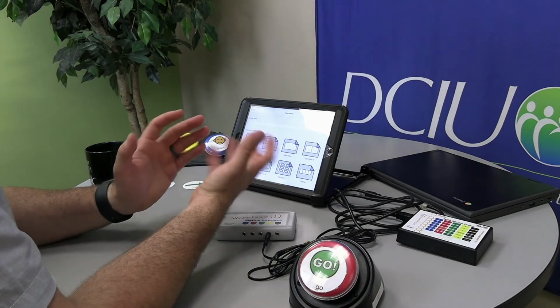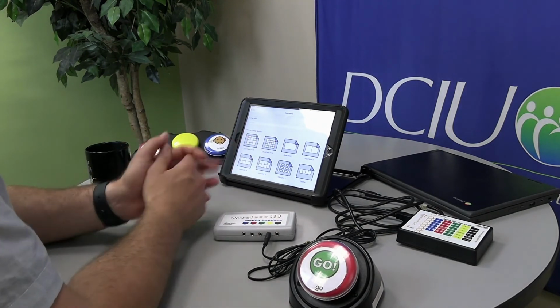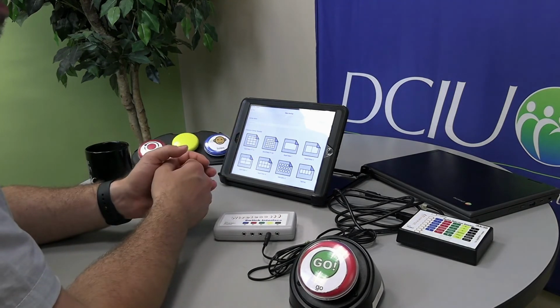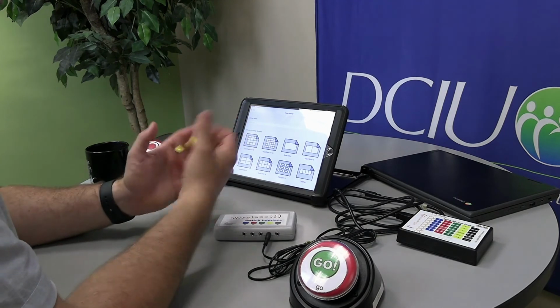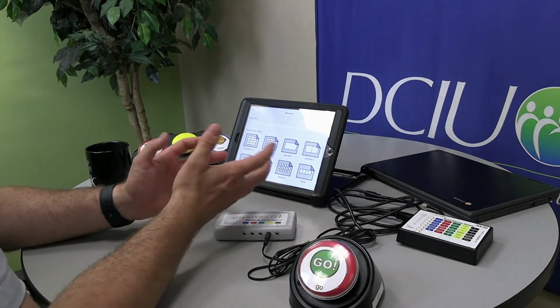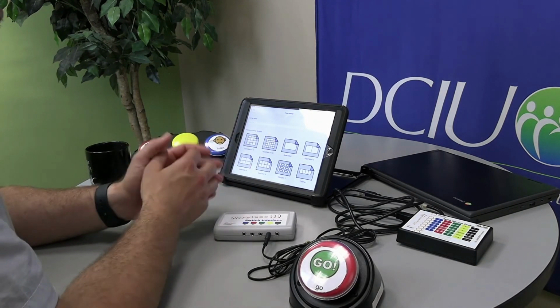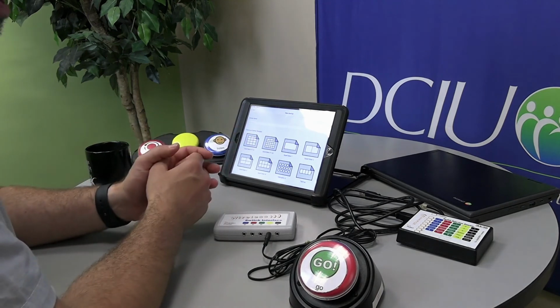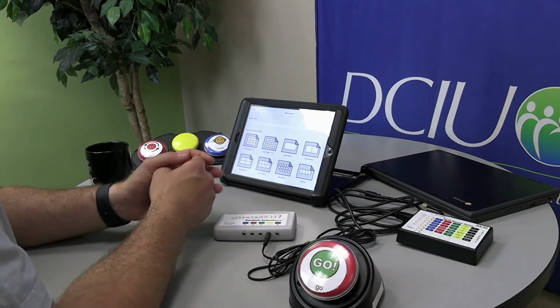So again, let's say there's something that's very reinforcing for the student, or maybe somebody they like to see in their day and would like to communicate with. You're able to go around with the iPad, take pictures of real things in the real world, and you can populate these device overlays to print out and utilize with the student. So again, free application, any iPad can get the application, and it just makes your work so much easier when it comes time to program devices.